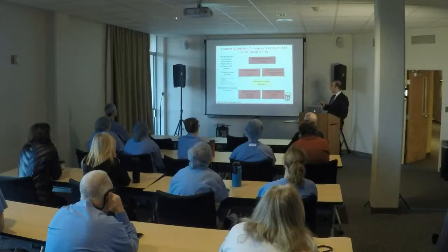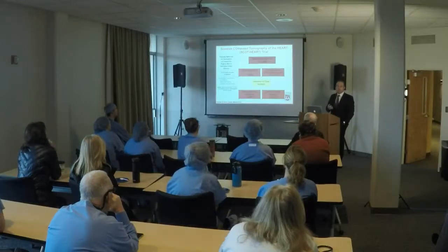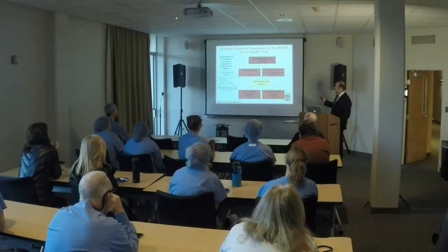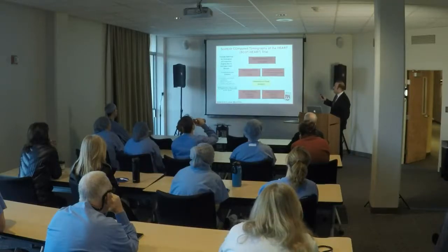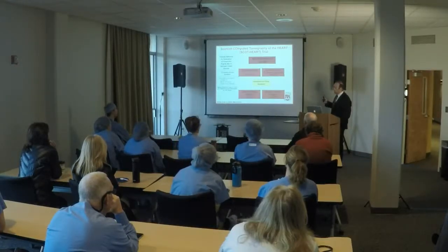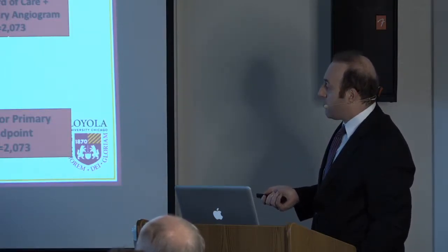12 centers across Scotland, and there were no restrictions according to whether they had baseline arrhythmia, which can sometimes be problematic in coronary CTA because you need to gate to RR intervals and you need to try to minimize cardiac motion. So they had no restrictions on arrhythmia. They were scanning patients with BMIs of 65, so very high risk patients that can degrade image quality significantly, and calcium scores of up to 9,000. So these were higher risk CT scans, but despite that, they were able to demonstrate pretty remarkable findings that I'll present. And the mean radiation dose was about 4.1 millisieverts.